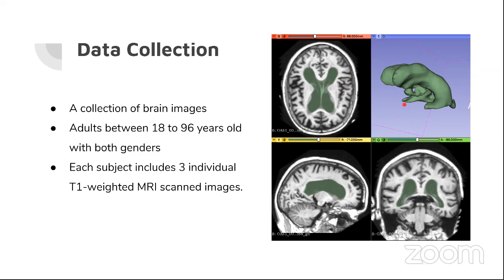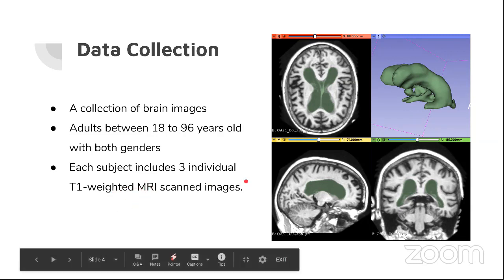Next, also in 3D Slicer, we transformed the diagonals of the segmented data to -1, -1, -1, 1, and converted them to a Python-ready format. Since the dataset is not large enough, data augmentation for both inputs and outputs is needed to prevent overfitting. So next, Yakun will talk about data process.